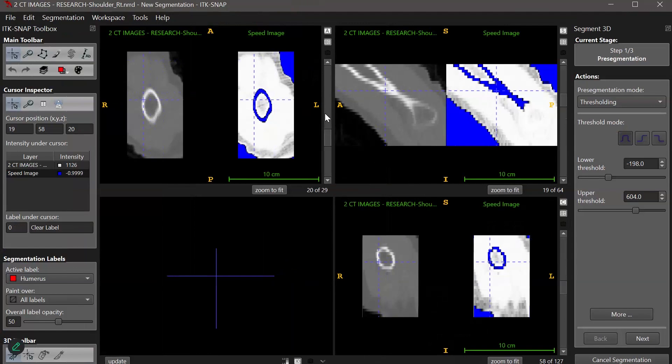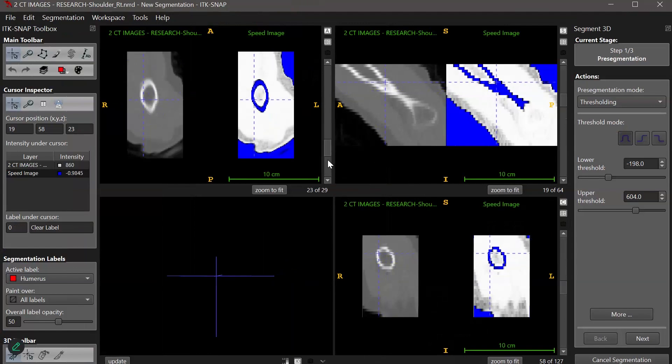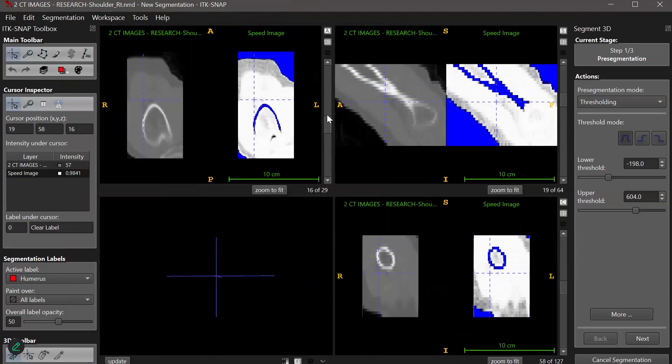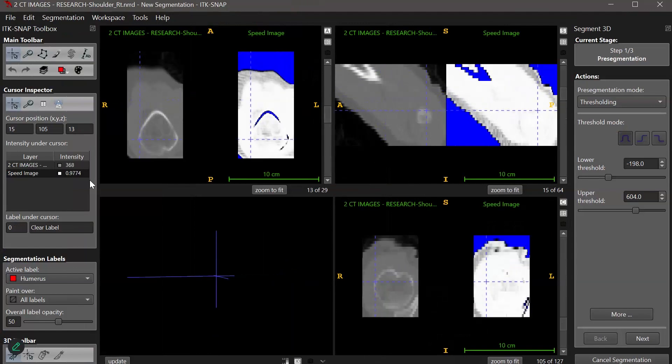Since I'm segmenting the humerus and it appears bright white in the CT image, I want to select values that focus on those brighter pixels.